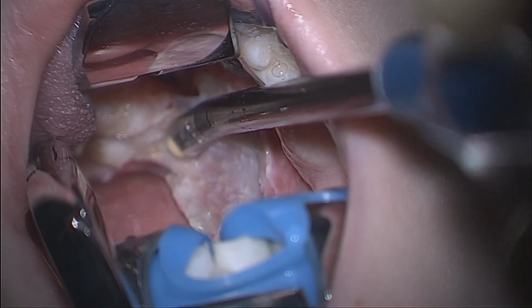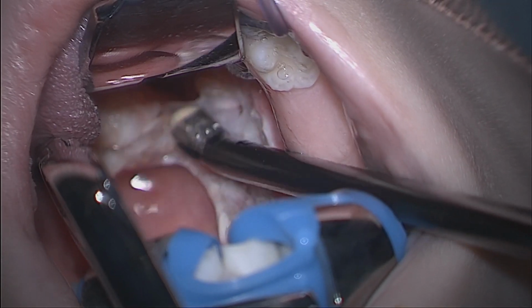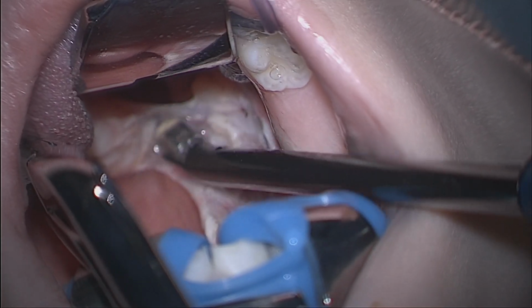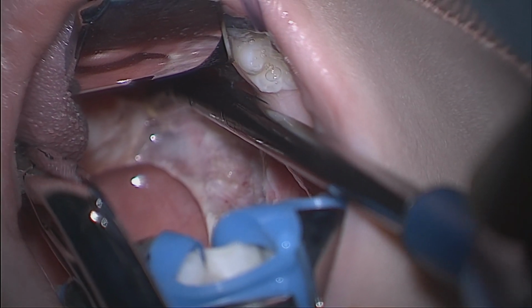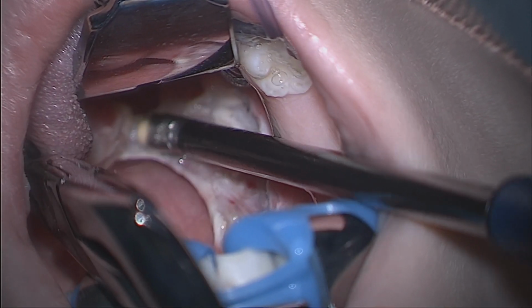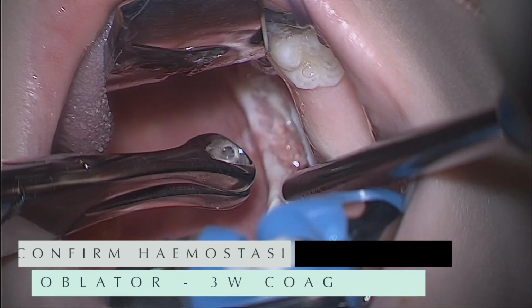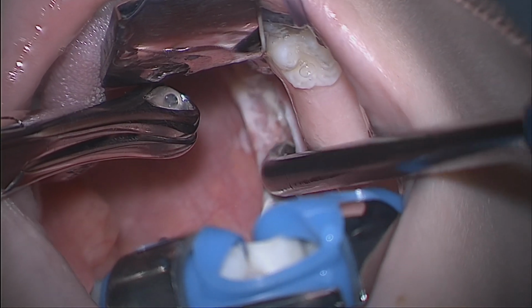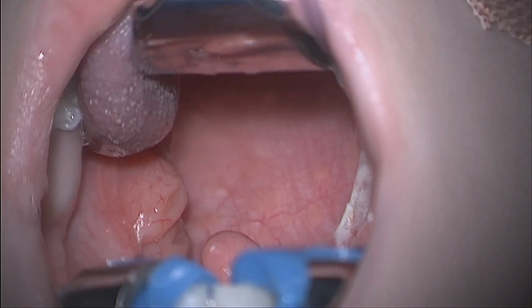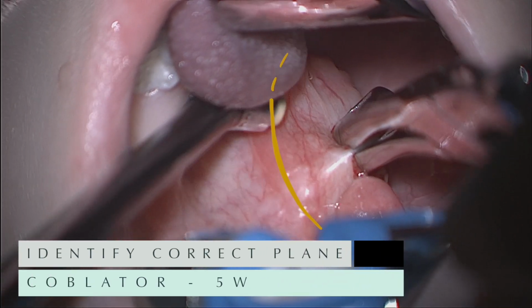The dissection continues all the way to the inferior pole, which is dissected circumferentially until the tonsil is removed in its entirety. Once removed, the bed of the tonsil is inspected for any actively bleeding vessels, which can be arrested with targeted cautery. Once I am satisfied that hemostasis has been achieved, I will then move to the contralateral tonsil to repeat the process once again.